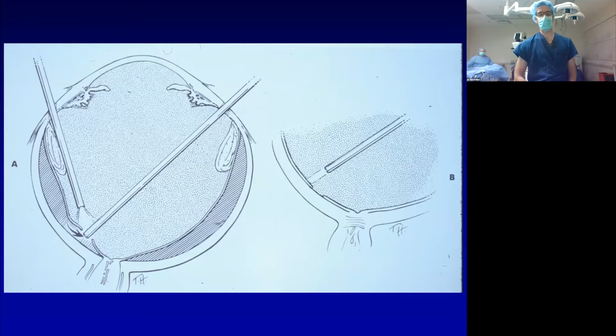This is showing a posterior retinotomy and drainage of subretinal fluid. The retina is detached right here. The subretinal fluid is the striations. We have a retinal break right here created by the surgeon using an instrument to suck the fluid out through that hole. Once the retina is reattached and flat, probably by putting air in this space, you fill this space with air while you're draining the fluid out of this space. A laser probe is used to seal that retinotomy site.